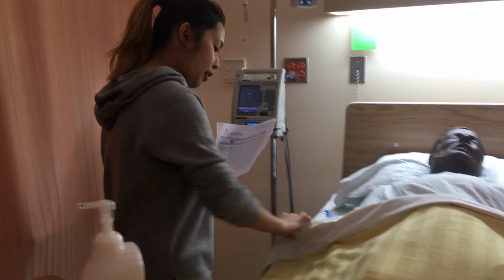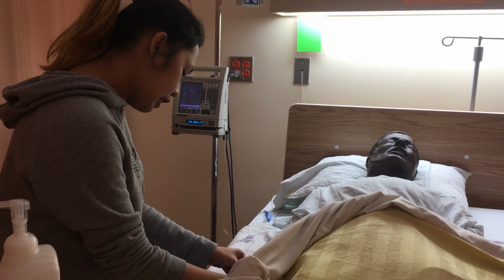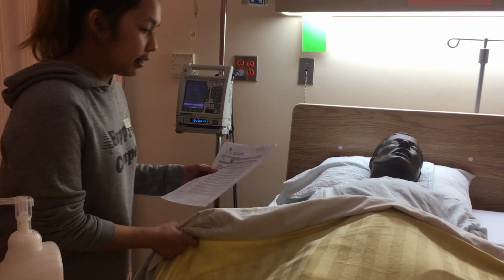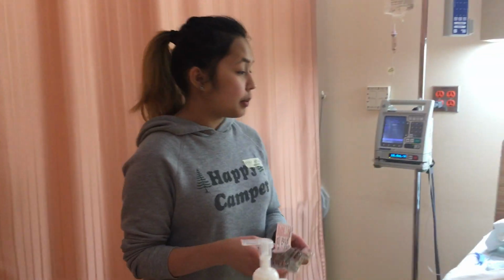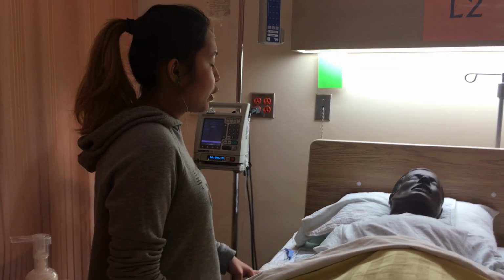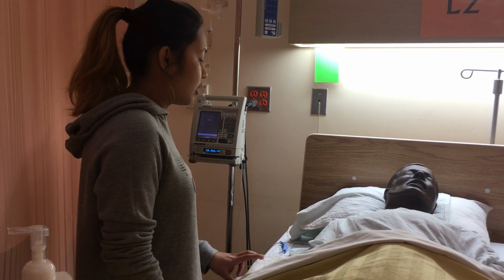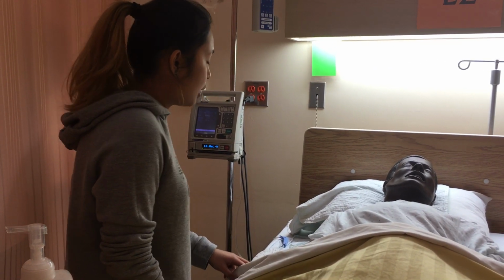I'm just going to check your armband here. Can you please state me your name and your birthday? And do you have any allergies that we need to know about? No? Okay. So Miss Phalange, I have here your medication, and this is the penicillin G sodium. This is an antibiotic, and it's to help with your endocarditis, which is your infection. Side effects of this medication include nausea, vomiting, or diarrhea. I will have the call bell within your reach, and you can just let me know if you're feeling any of that.